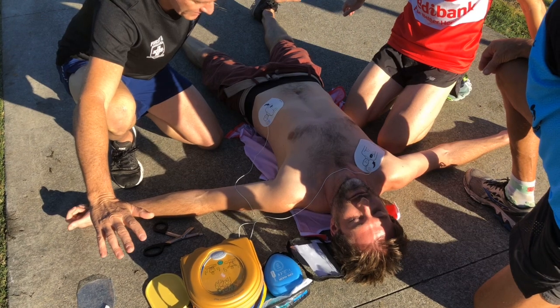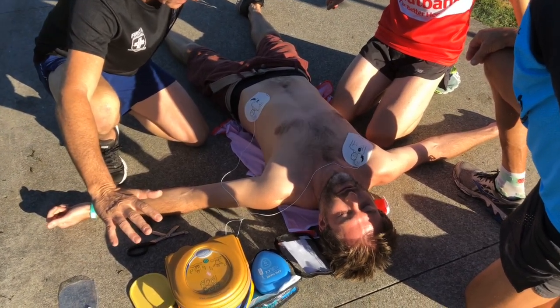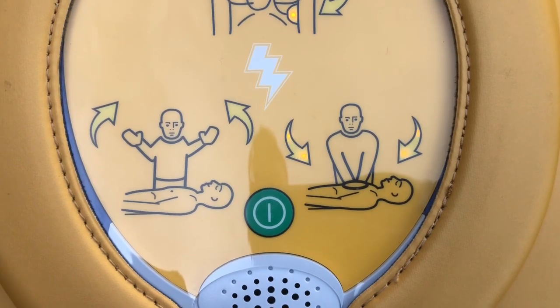Stand clear of the patient. The shock will be delivered in three, two, one. Shock delivered. Begin CPR — it is safe to touch the patient.